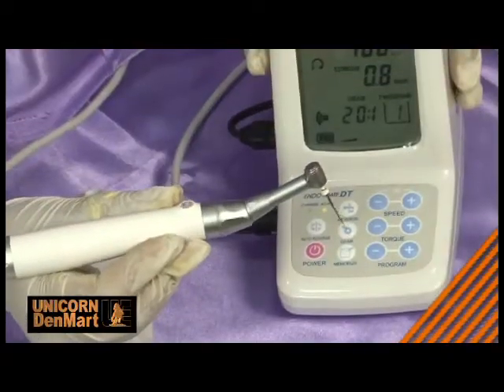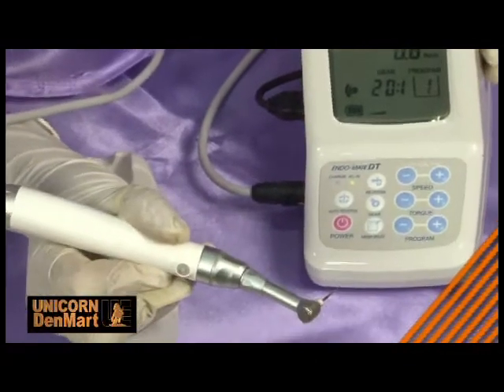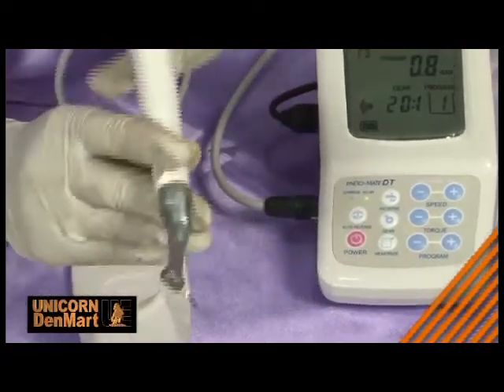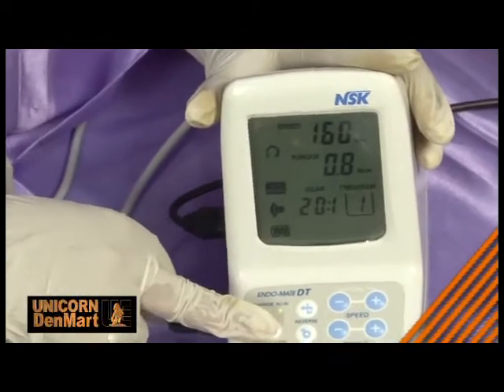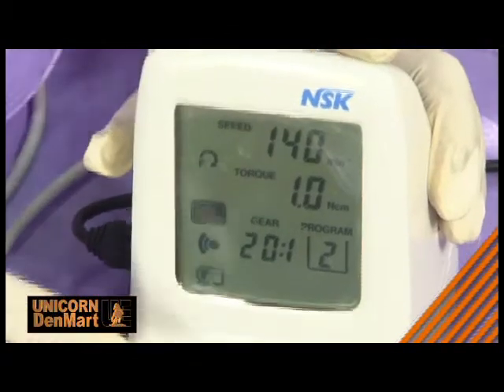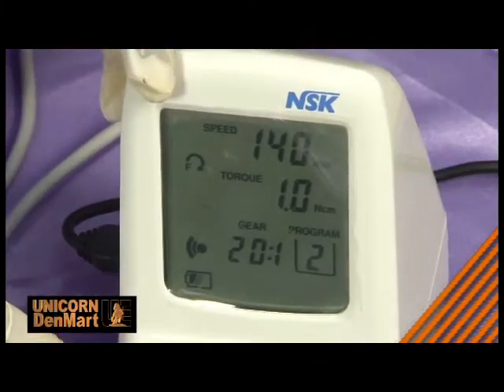Combining ergonomics and aesthetics, the handpiece is convenient and works well even during extended treatment periods. Its wide screen LCD display offers clear visibility of various functions, including auto reverse mode and battery status, assisting the user in operating the equipment with ease.